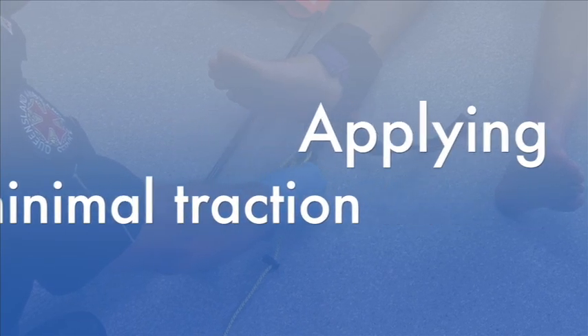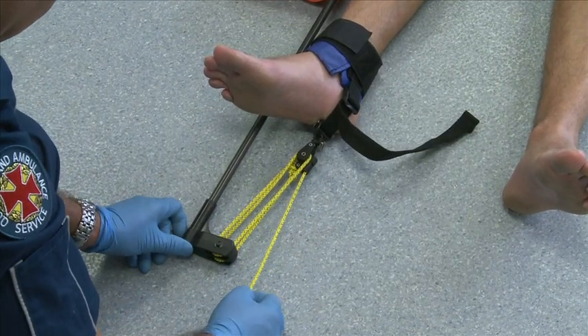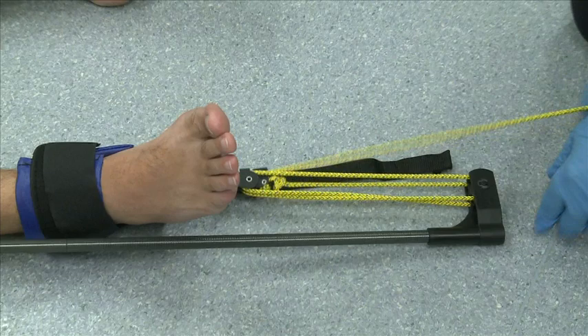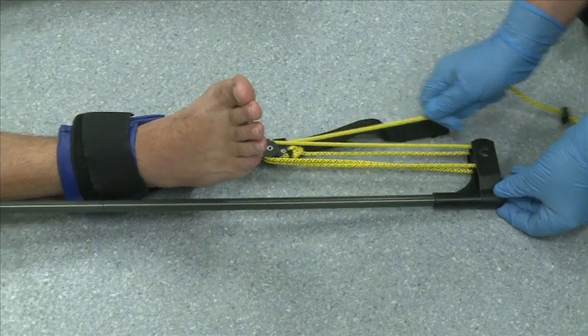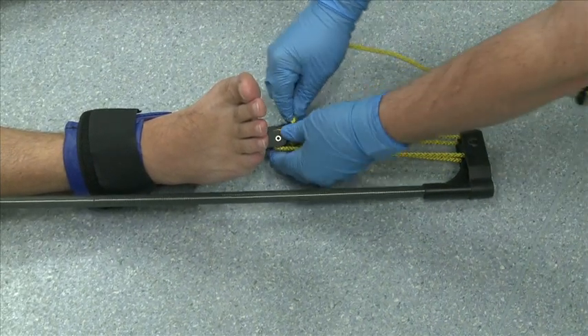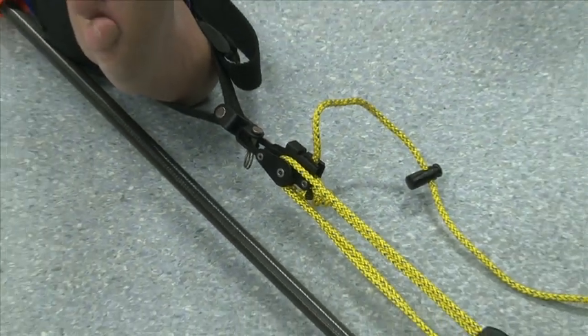Step 8 — Traction: pull the line to apply a minimum amount of traction so that the splint is resting in its appropriate position. This is achieved by pulling the loose end of the line exiting the purchase block and line mechanism below the patient's foot. Now lift the line up into the V-jam cleat to achieve tension — the V-jam cleat will hold the line secure.